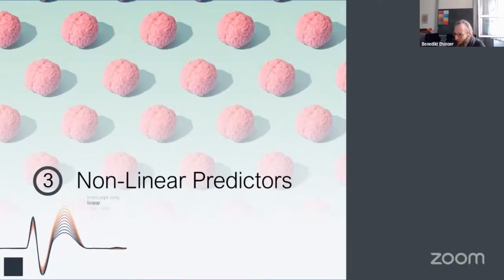Yeah, we are back. We already learned mass-univariate regression ERPs, including continuous effects and marginal effects. And I think this is all really advanced stuff already. I think you should all be proud that you're still sticking around, right? But we will continue. There's no time to stop this train. We will only stop after overlap correction, and we will just jump right into it.